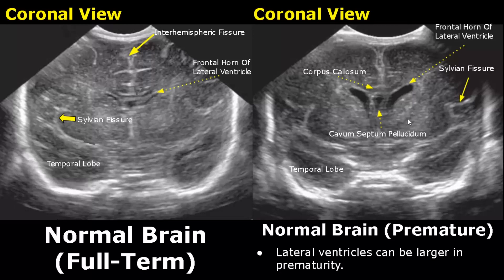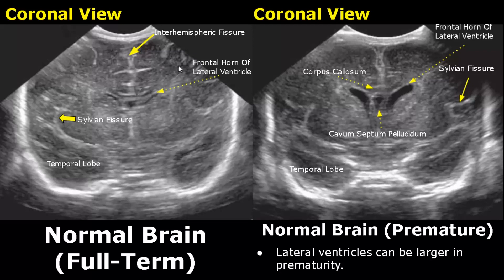This line is the sylvian fissure and below that is the temporal lobe on both sides. Over here is an image of a normal brain in a premature infant. They usually have larger lateral ventricles as compared to full-term infants. Another difference is the prominence of sulci — premature infants have fewer sulci seen on ultrasound, whereas a full-term infant has more prominent sulci.